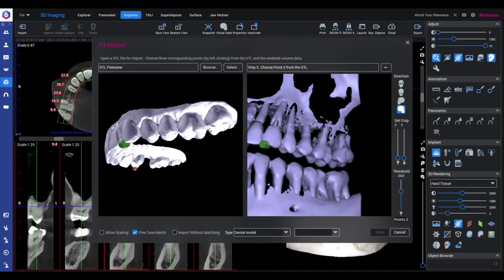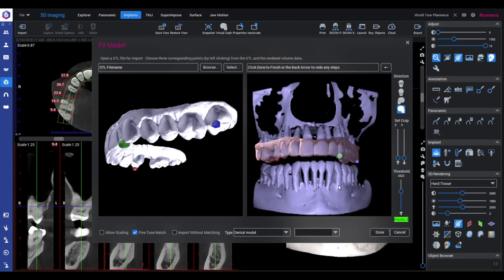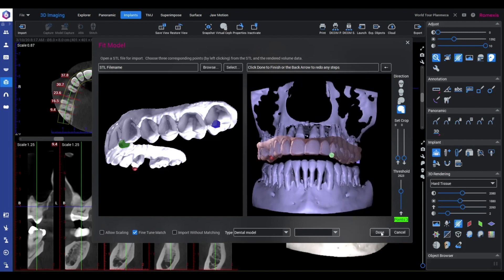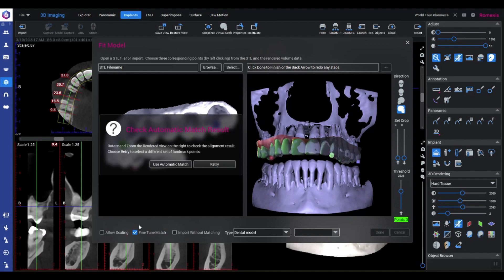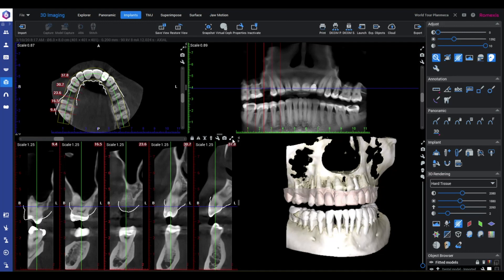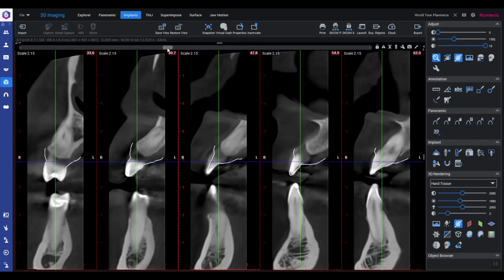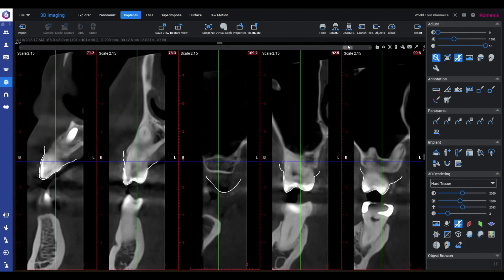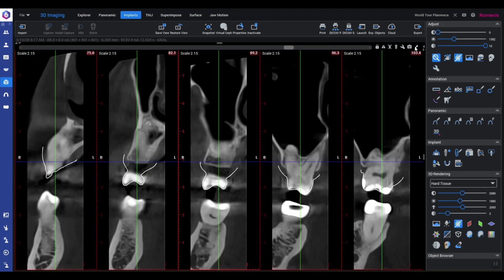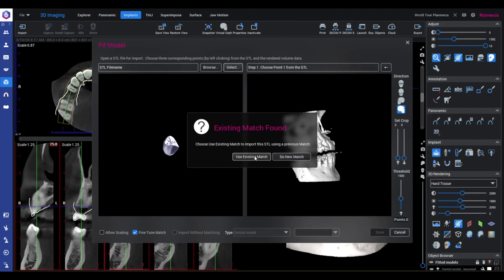I used to pay a service to do this step for me, and indeed some software systems require you to do that. However, now that I've started doing it myself, I prefer it — number one, because it's so quick and efficient, and number two, because I'm able to verify the quality of the merge. All we have to do to verify is scroll through our panoramic curve cross-sections from one side of the arch to the other and examine the overlay of the intraoral scan with the CBCT. You can see here that the fit is perfect throughout. I recommend doing full arch intraoral scans and merging those with a CBCT in which you've captured the entire full arch, so that you can verify the quality of the merge.